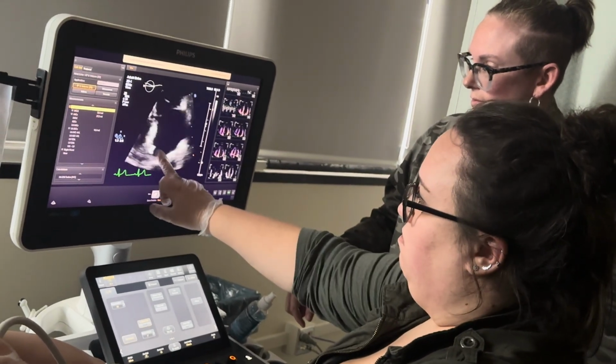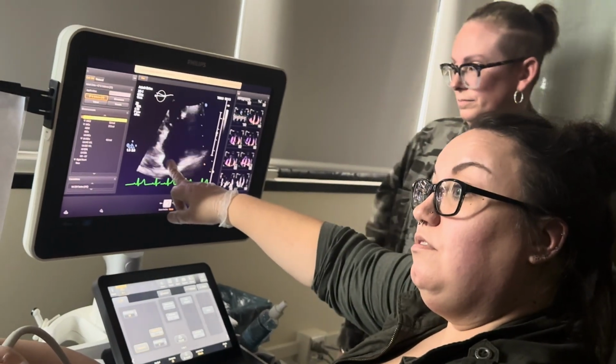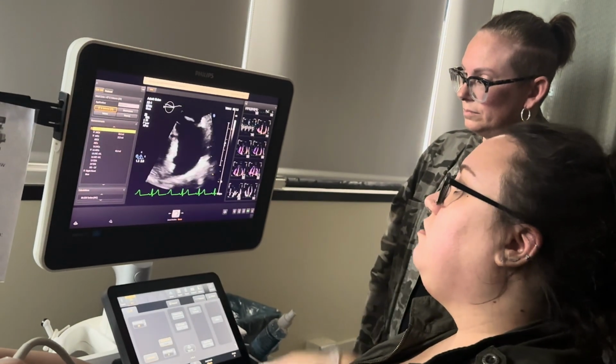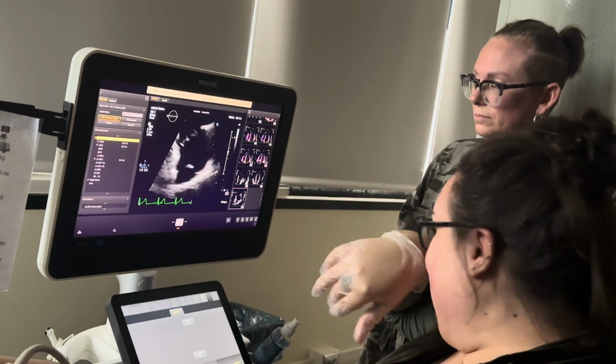Oh, wow. It's just a remnant. So what is the Eustachian valve? It's a fetal remnant from the embryo. And what was it used to cover? The interatrial septum, the coronary sinus, or the IVC. The IVC, that's one of the two.